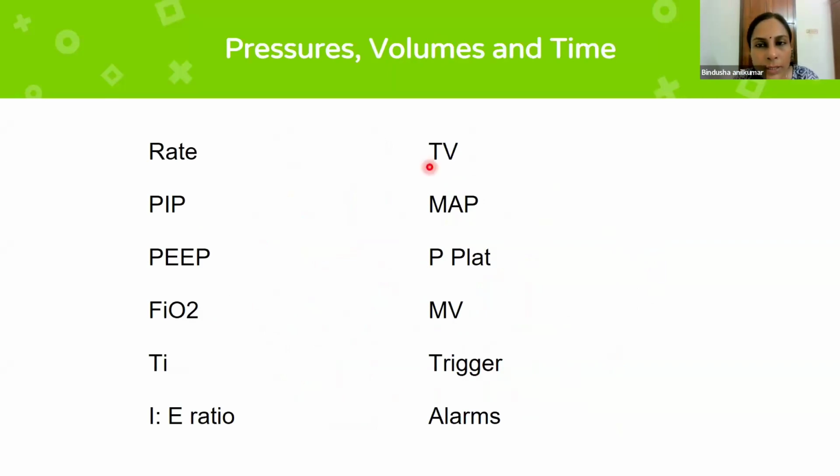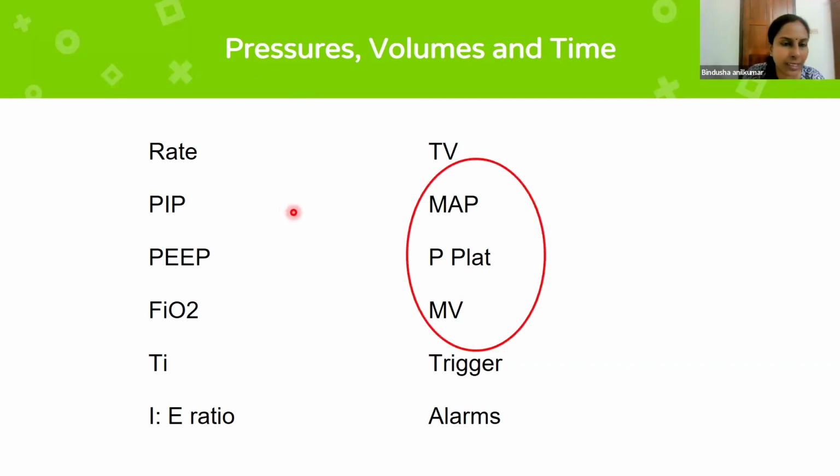Now we are going to the next part: what are the pressures and what are the values that you see? What are the values that you set? Some of these values we set in the ventilator and some will be seen in the ventilator.